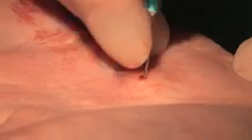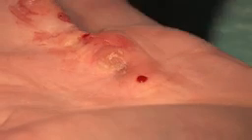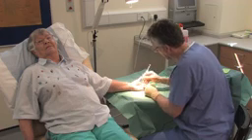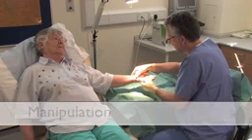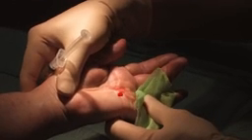It is important to change the needle regularly if it appears to be becoming ineffective, as a sharp bevel is required for effective needle aponeurotomy. Once the cord has been divided as much as possible with the needle, the finger is extended to help break any remaining fibres of the cord and reduce the flexion contracture.